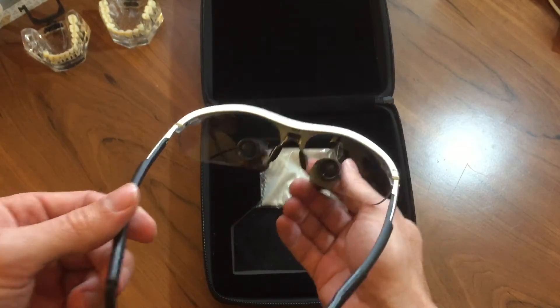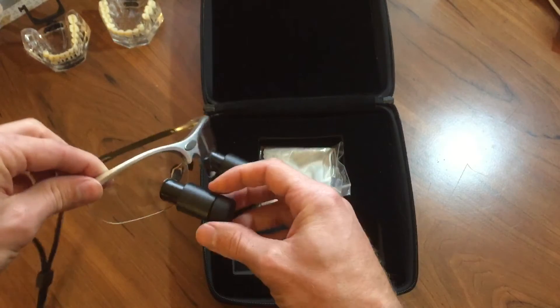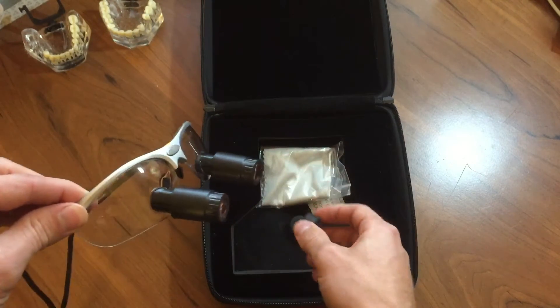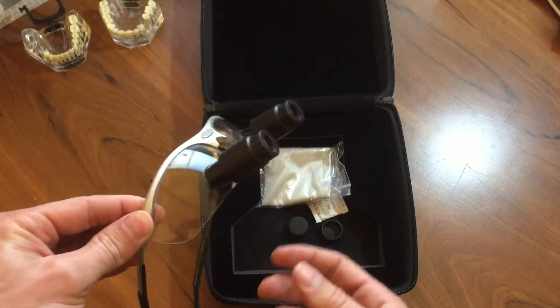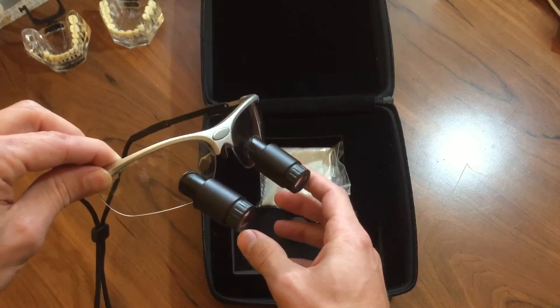So yeah, stylish, very good, very light. I really like them a lot. They're very good entry-level loops on the higher magnifications for an experienced dentist.